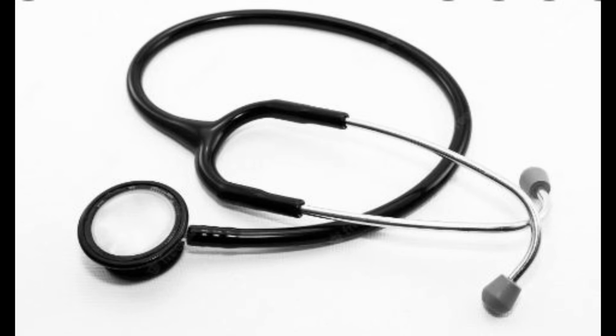So, by using the diaphragm of your stethoscope, you can hear the first heart sound at the apex of the heart, a lub sound, especially in the mitral and tricuspid areas. Regarding the frequency or pitch, the first sound is long, dull, and booming in character with a low pitched sound. While hearing the second heart sound, S2, there is a split between the aortic and pulmonary valves, especially during inspiration.